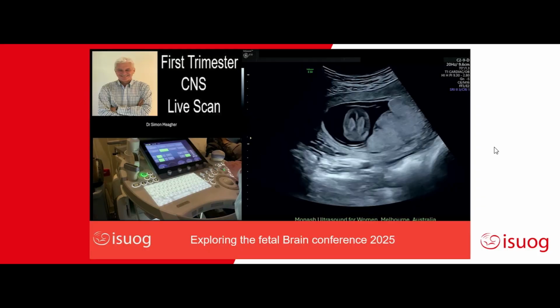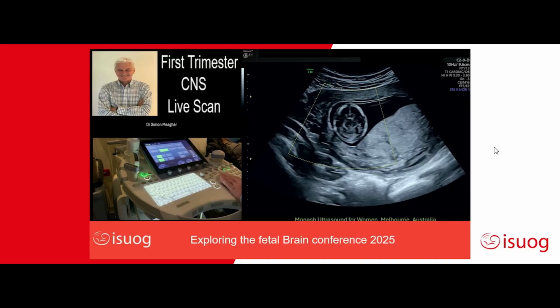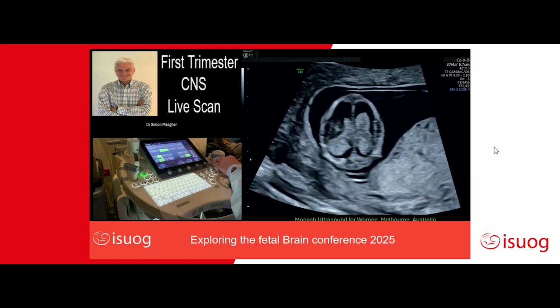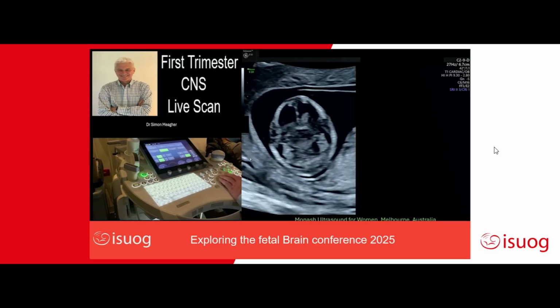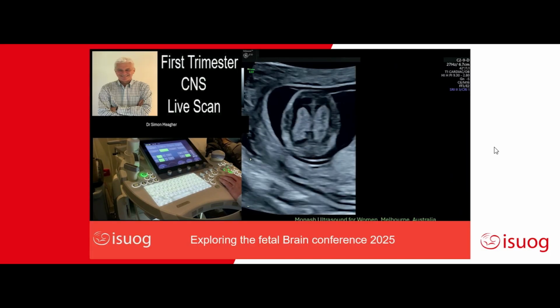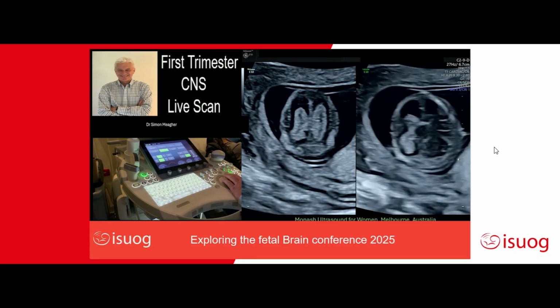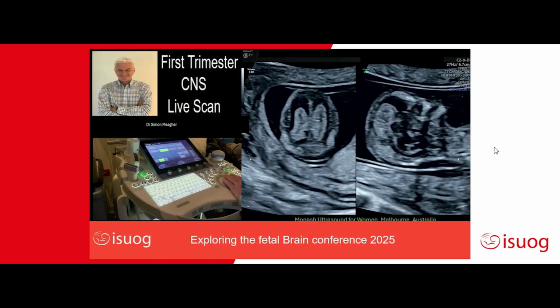And that's why I encourage you to come around to get this section where you have an axial section through the fetal head with symmetry of the choroids. Now you can see the baby's moving, but that's in a sense why it may be a difficult measurement to obtain just going straight to sagittal. Whereas you go to axial, and I have symmetry, and I'll split it for you. You have a perfect axial section with the symmetry of the choroids, and all you do is just flip your transducer 90 degrees to that, and then all your brain landmarks come into view.